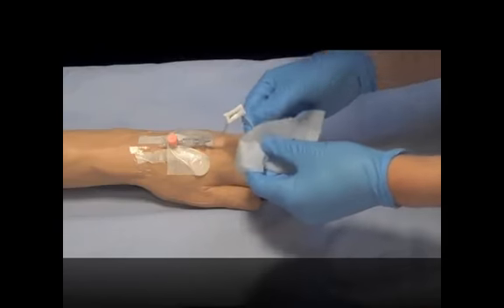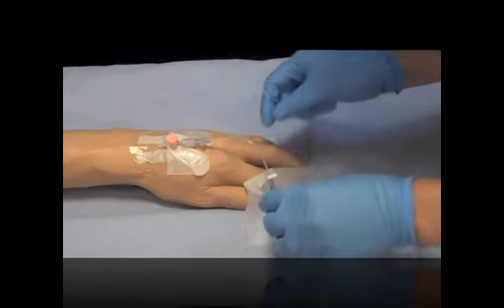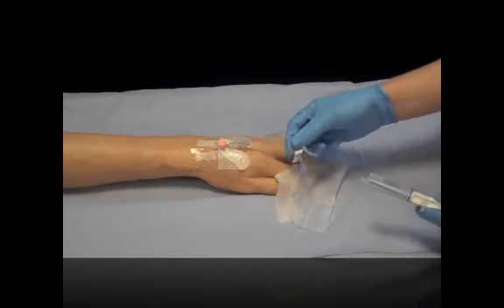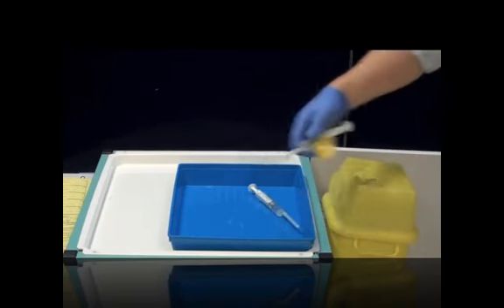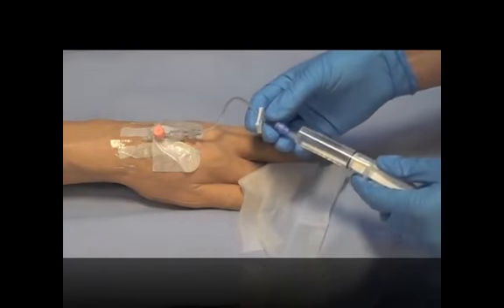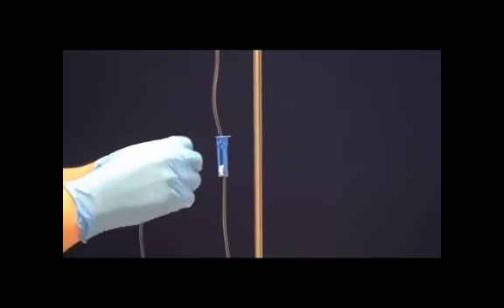Take one of your wipes and thoroughly clean the injection port on the cannula. This one's got a one-way valve on it. Remember, that's your key part, so keep it clean. Remove the needle off the end of your flush and flush the cannula with a couple of mils of saline. Once you've done that, replace the needle. Take your antibiotic and get rid of that needle. Connect it up to the injection port and over approximately 5 minutes deliver your antibiotic.